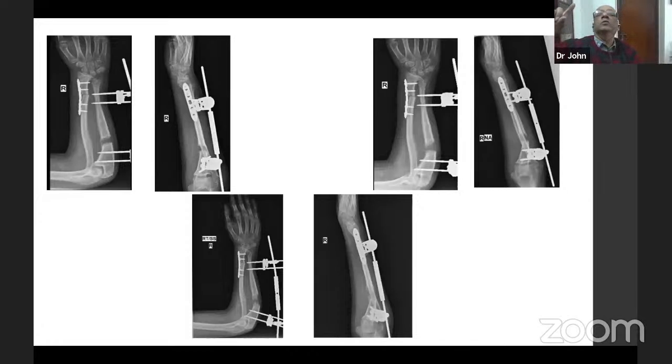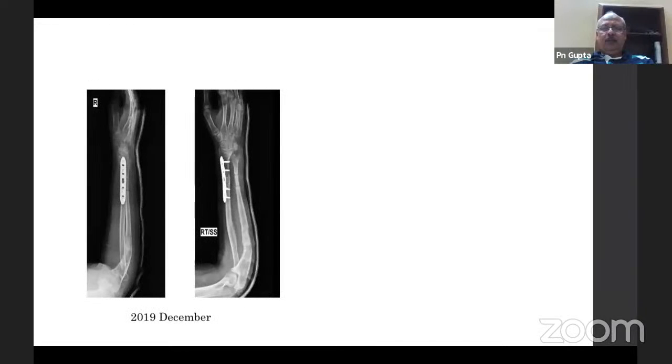At this stage, there are one or two things you could have done. One is to transfix the radius with your distal pins. So when you lengthen, you have a better chance of the radial head coming back. And I would use a stronger fixator, either an LRS type or even a ring fixator at this stage. I am not so comfortable using a ring fixator in the forearm. You could use an LRS. Yes, LRS is a good option. Pediatric LRS is available and it has pretty thin pins which you can use.